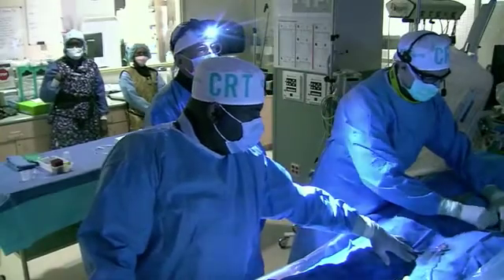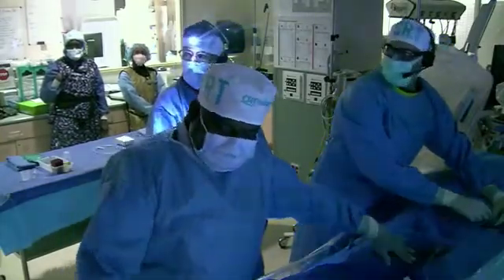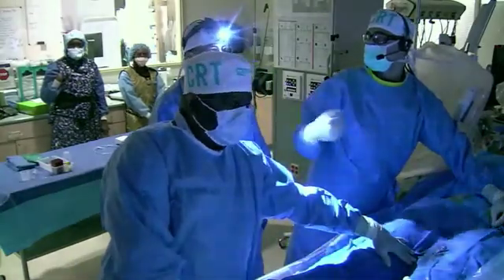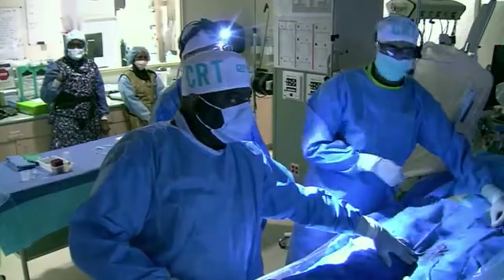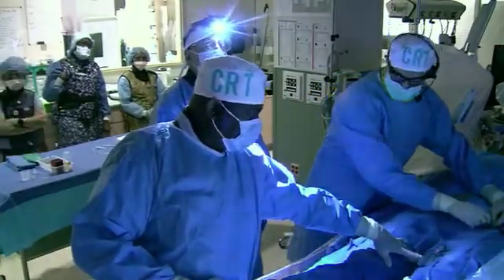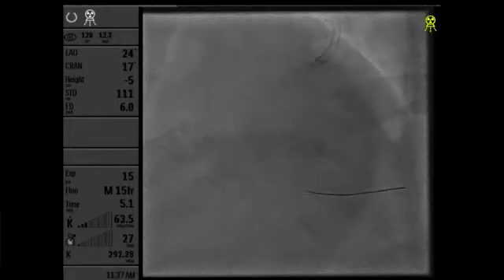Actually, I'm looking at the OCT, Hader. You have a ridge there. That's why it's most likely getting caught on the ridge. So this is the distal part. If you go to the proximal part, I think the stent was looking fine. Yeah, there's a ridge. That's why you're getting caught in that. It's a bulky balloon, a very good balloon, but it's just bulky. Can you get the Shockwave ready again? I'll use it to deliver my guide extension.